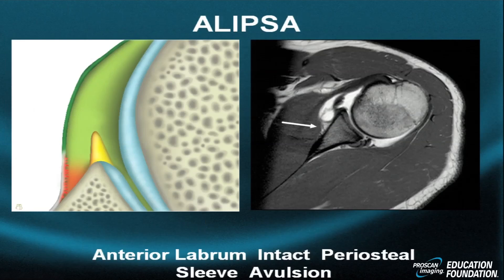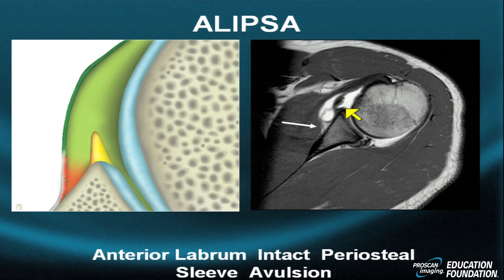Then finally, the elusive ALIPSA. We have the ALPSA, but what's an ALIPSA? An ALIPSA is an anterior labrum intact periosteal sleeve avulsion — in other words, the anterior labrum remains intact but the periosteal sleeve is affected. There is your labrum — a bit diminutive, but present — along with a thickened middle glenohumeral ligament, a distended capsule with synechia inside, and the elevated periosteum with a triangular area of edema and hemorrhage, corresponding beautifully to the accompanying diagram. In summary, an ALIPSA is a periosteal injury that is more medial in position with preservation of the labrum.